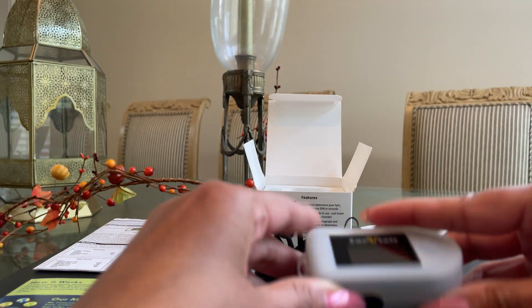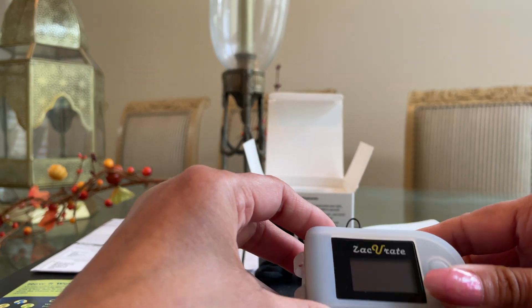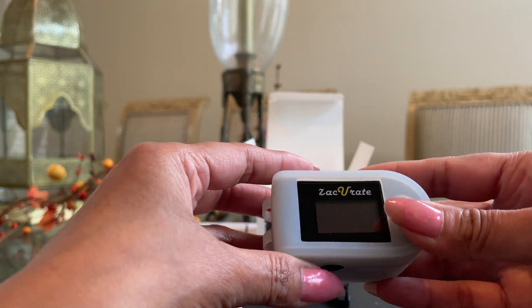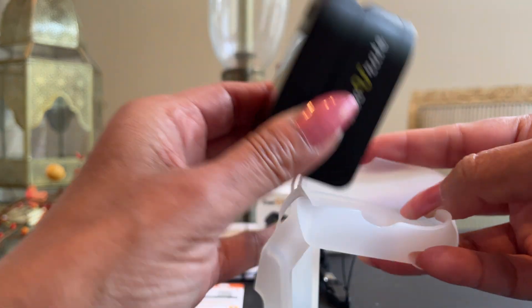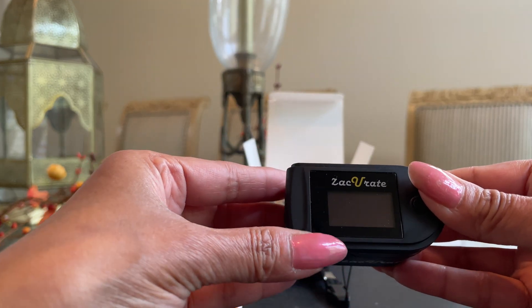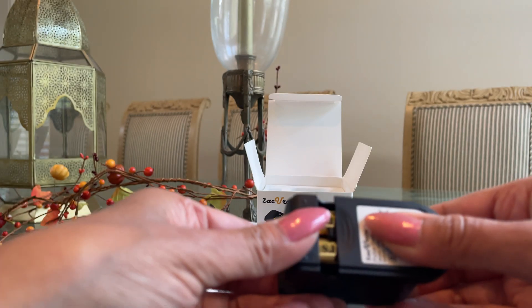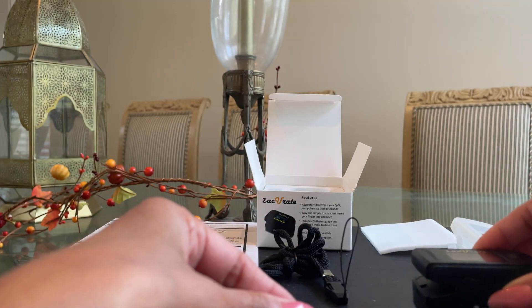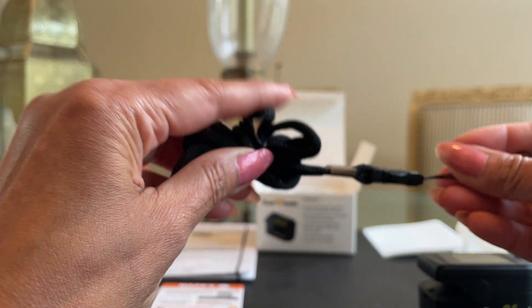First, the pulse oximeter comes encased in a silicone cover to protect it in case you were to drop it — just like we have covers for our smartphones, it's a similar concept. It's lightweight and easily comes off. This is the actual Zaccurate 500C pulse oximeter. It also comes with a bonus of two AAA batteries, which I put in a short while ago, and it comes with a lanyard for portability and on-the-go use.